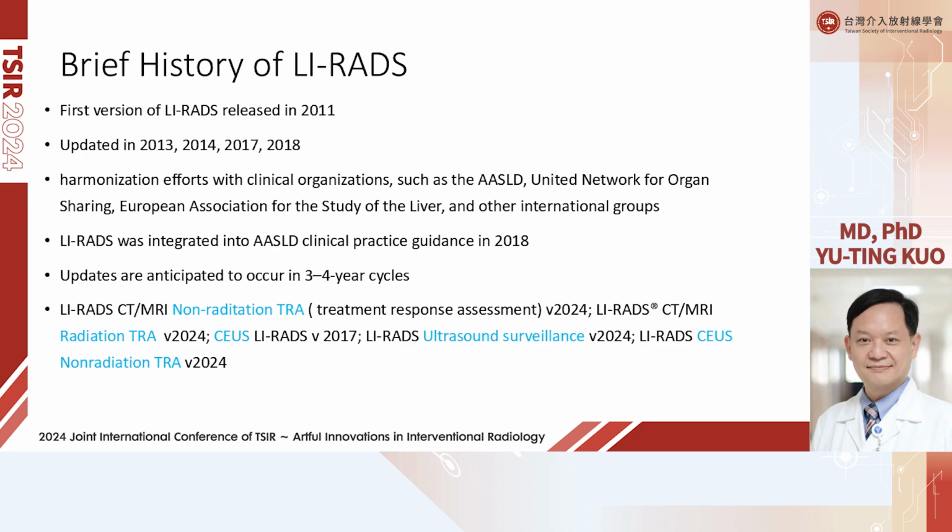Now we have the LI-RADS non-radiation treatment response assessment version 2024, LI-RADS CT/MRI radiation TRA, contrast-enhanced ultrasound LI-RADS 2017, ultrasound surveillance 2024, and contrast-enhanced ultrasound non-radiation TRA.